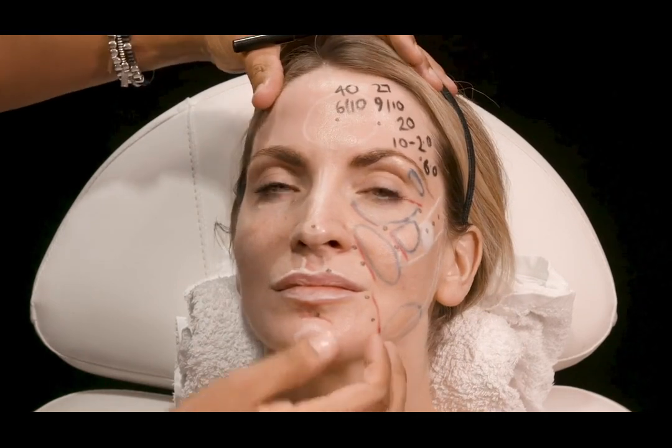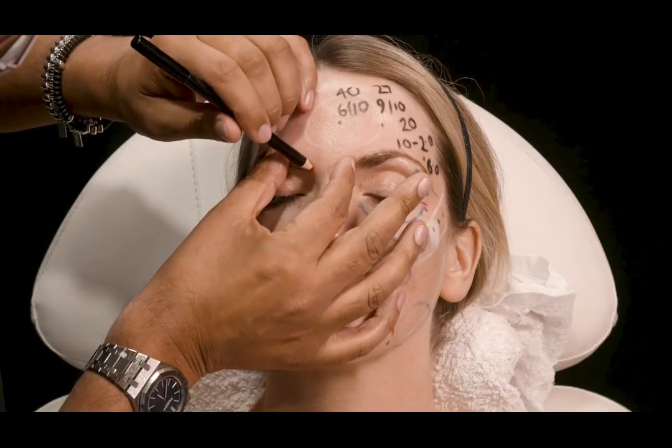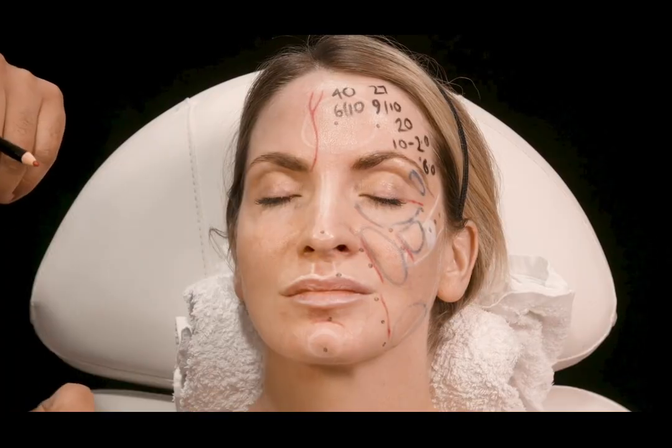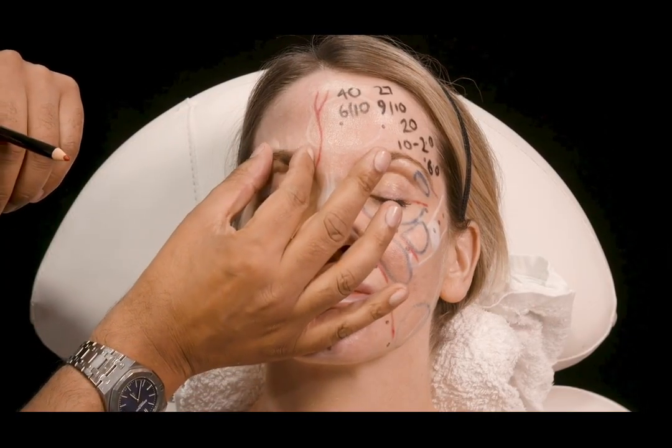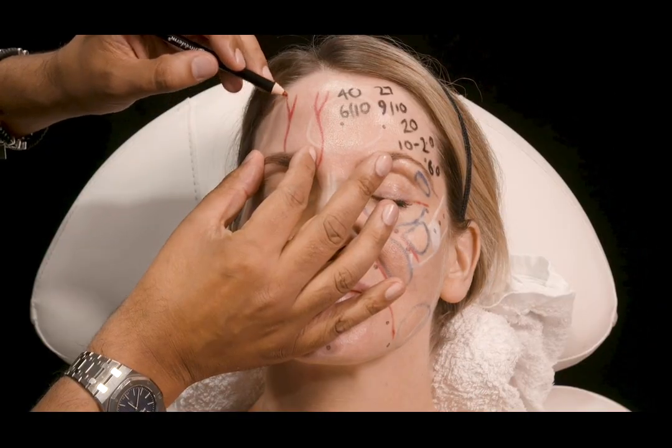For those of you that don't routinely inject the forehead, let's give you some reassurance. When I pinch the skin here, you can see the entrance of the supratrochlear artery into the forehead here. When I pinch in the midpupillary line, you can see that the supraorbital artery comes in here.